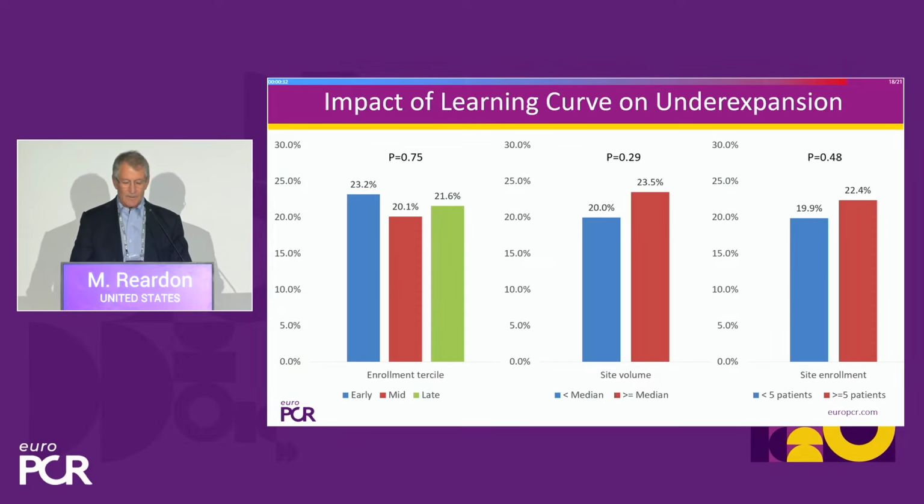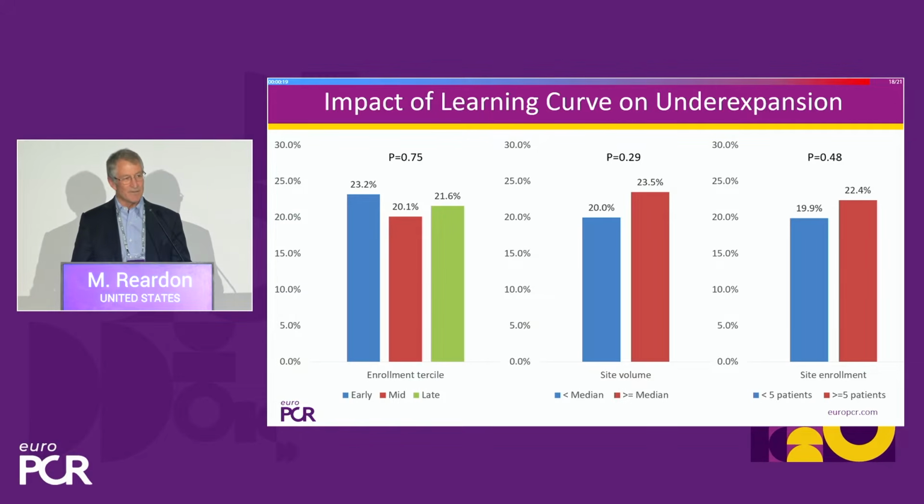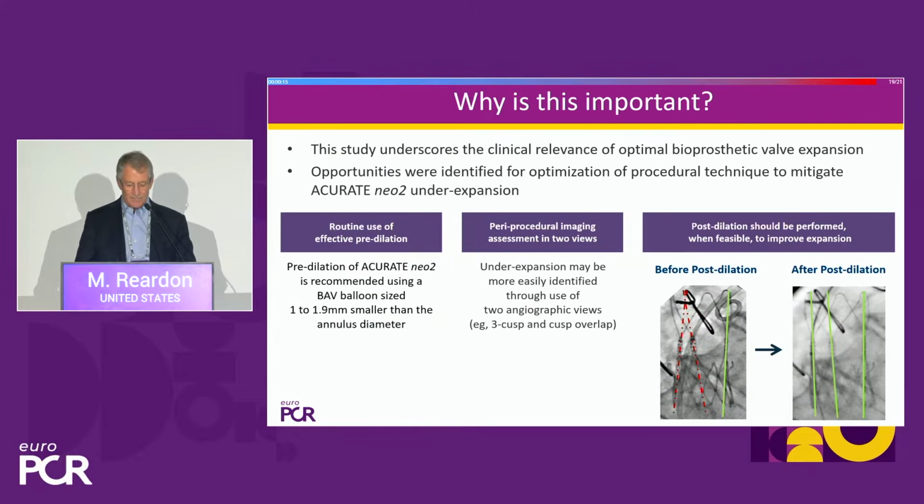If we look at the impact of the learning curve, there's no impact on the learning curve. It didn't matter how many your site enrolled, didn't matter how many you did. But again, the most done by any one surgeon in this trial, I think, was like 15. So nobody had a lot of experience with this. And again, most sites are doing this once every 3 months. It's very hard to build knowledge of how these valves should look if that's what you're doing.